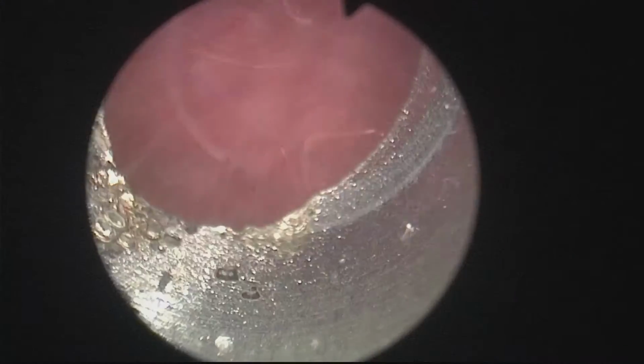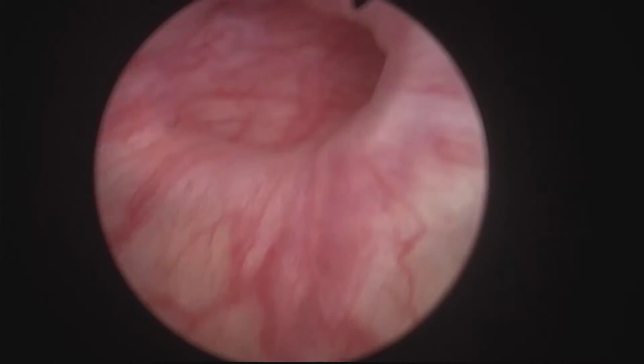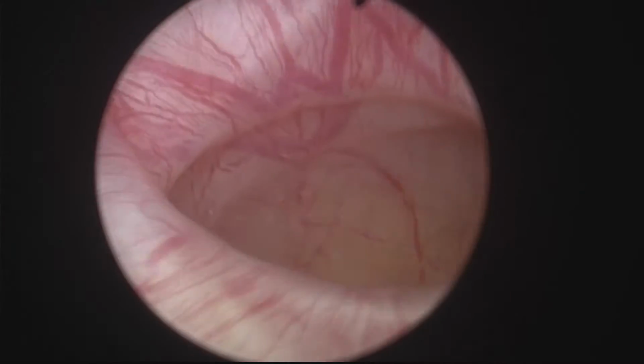I find it nicer than using the Ellik evacuator or the syringe, because when you do the Ellik evacuator thing, the position of the scope is not known. You don't know where it is, you don't know where you're going to be sucking the bladder. So there were some other small diverticulums.